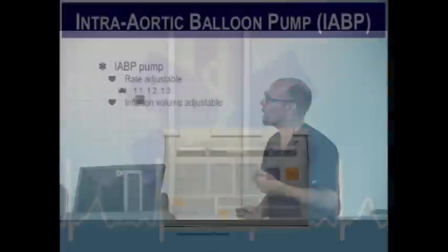Years ago, when I first started out as an ICU nurse, you were screwed if your patient went into atrial fib. You could spend hours just timing the pump instead of trying to deal with the arrhythmia, because the balloon would be inflated during systole and all kinds of nasty stuff would happen. So again, I can tell you're listening and understanding what I'm saying.